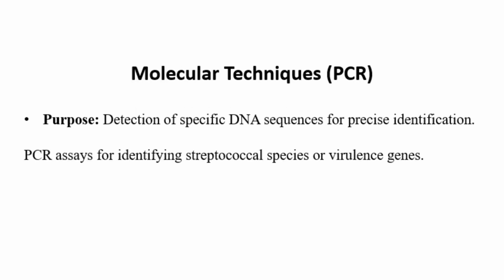Here are some molecular techniques, like PCR. The purpose of PCR is detection of specific DNA sequences for species identification. PCR is used for identifying streptococcal species or virulence genes.